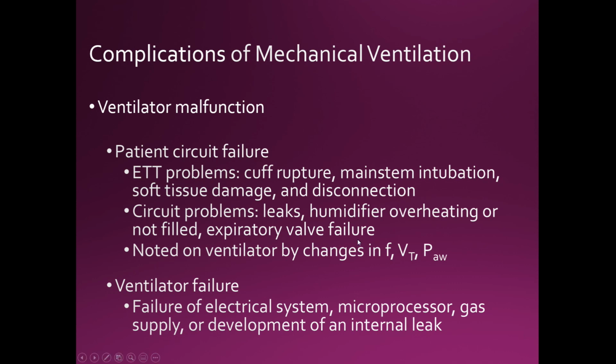Expiratory valve failure, you'll see that a lot more, or you'll catch those when you start doing ESTs or SSTs. Those are just tests that we do on the machine before we put it on the ventilator. Or let's say we discharge the patient on a vent, we clean the vent up, we run an extended self test, EST, and then we put a new circuit, and we put a bag over the ventilator for storage. So at least we know that when there's an emergency, we can grab the ventilator. We know it's been tested, it's passed, and so we just slap it on the patient.